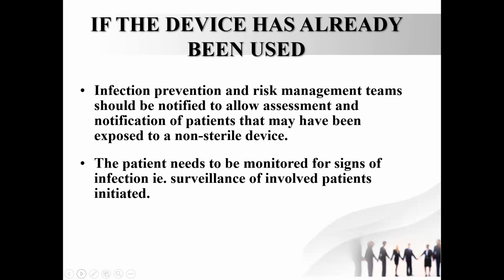And you have to also trace which pack is used on which patient, so you will see which patients those packs have been used on, which may have been non-sterile. That patient will have to be monitored for signs of infection. That means surveillance of the involved patients will be initiated by your ICN or infection control officer.